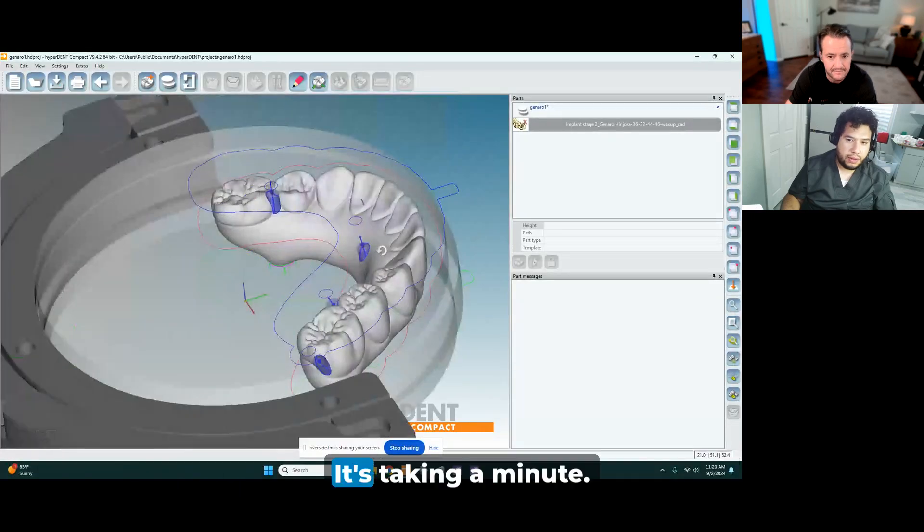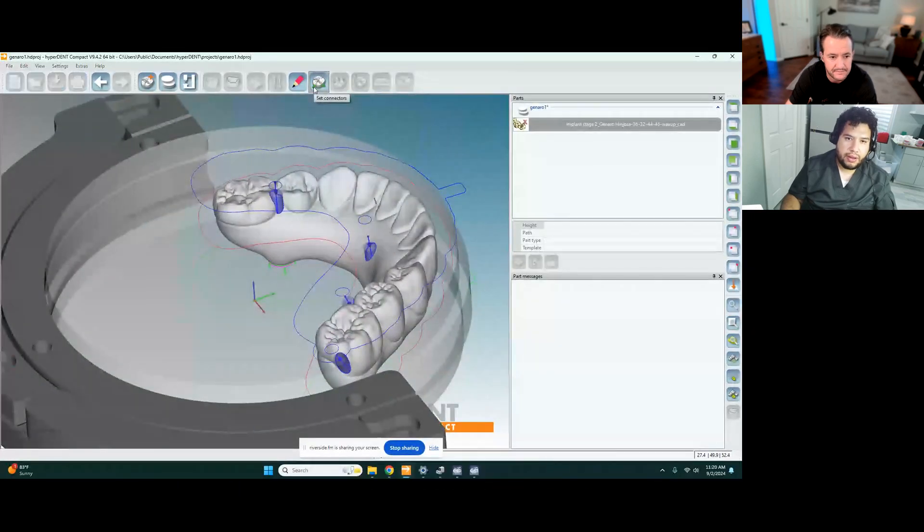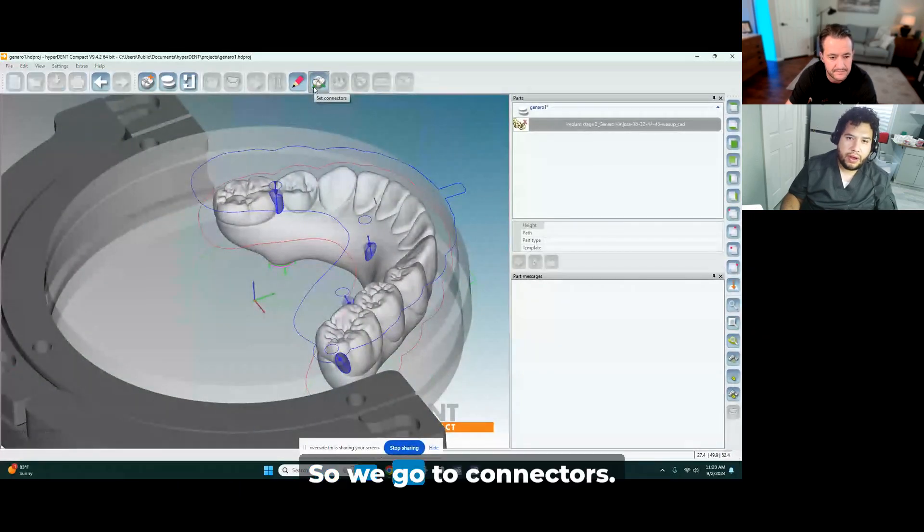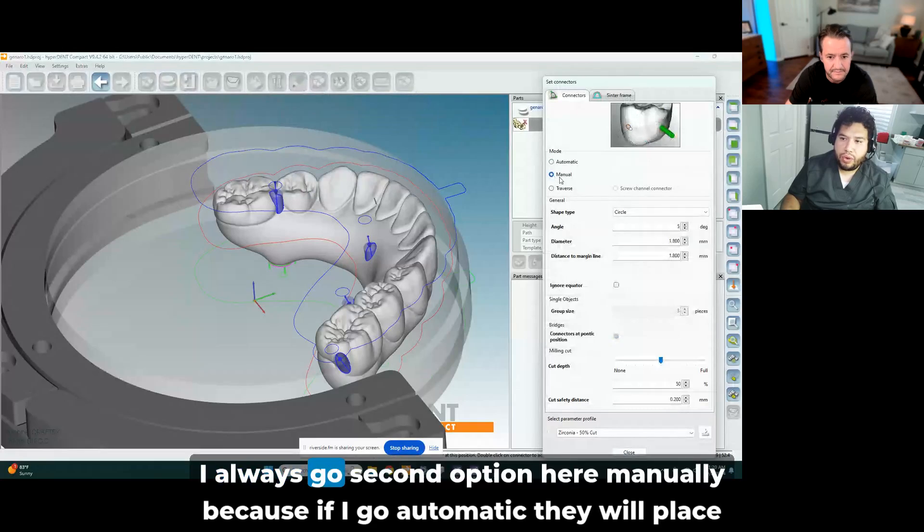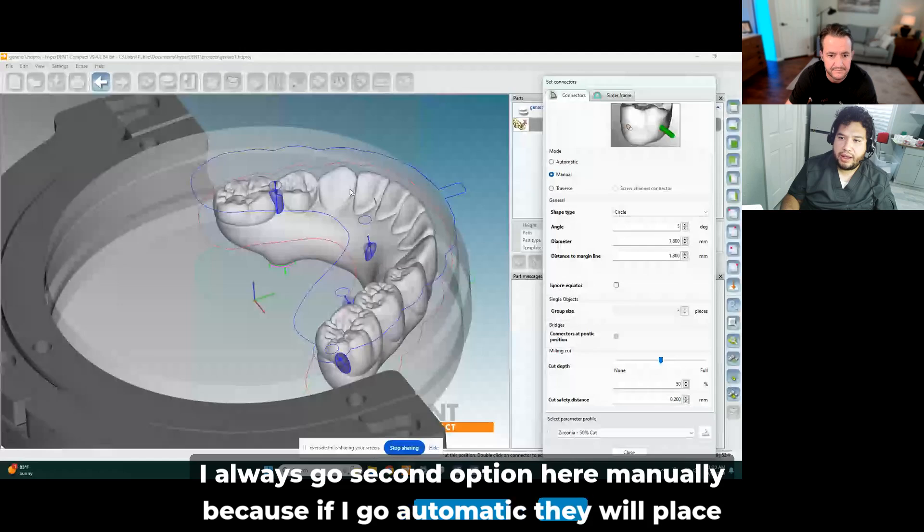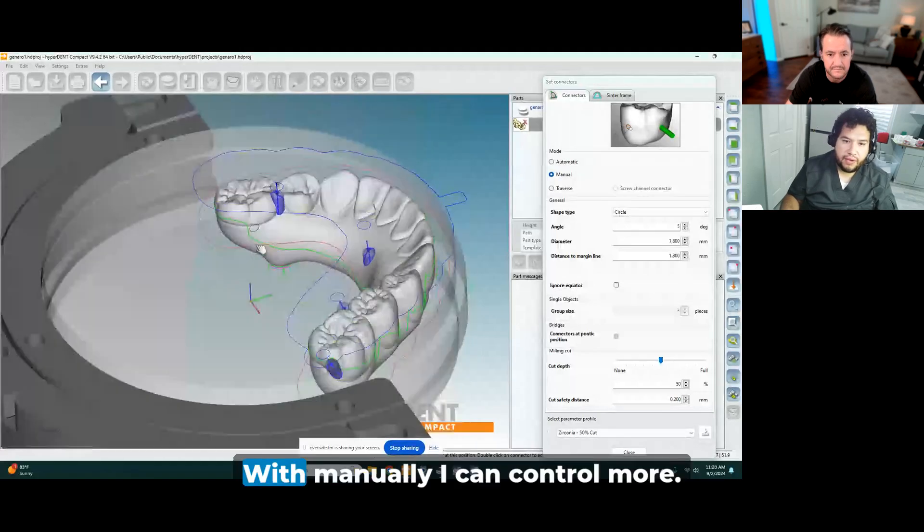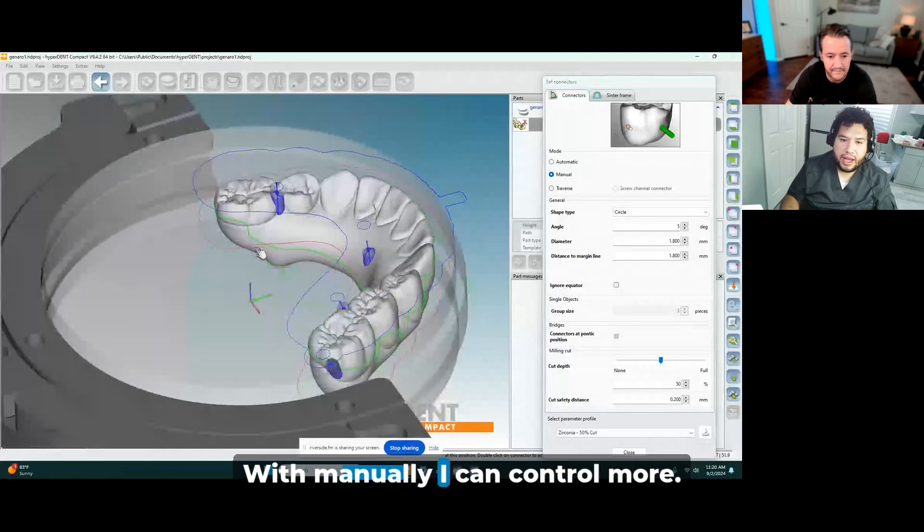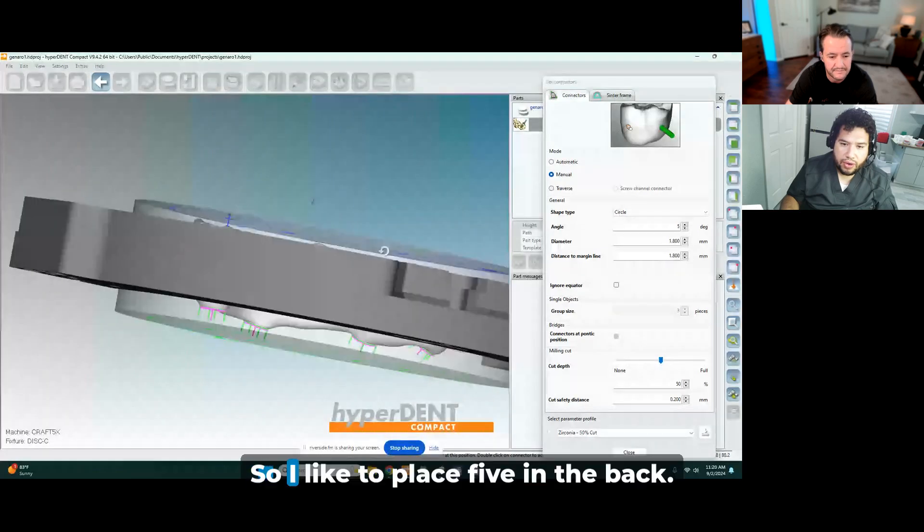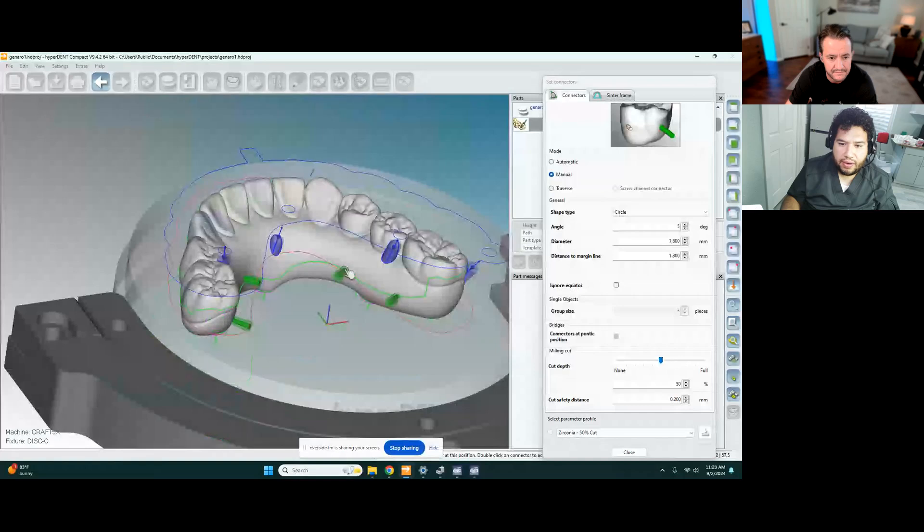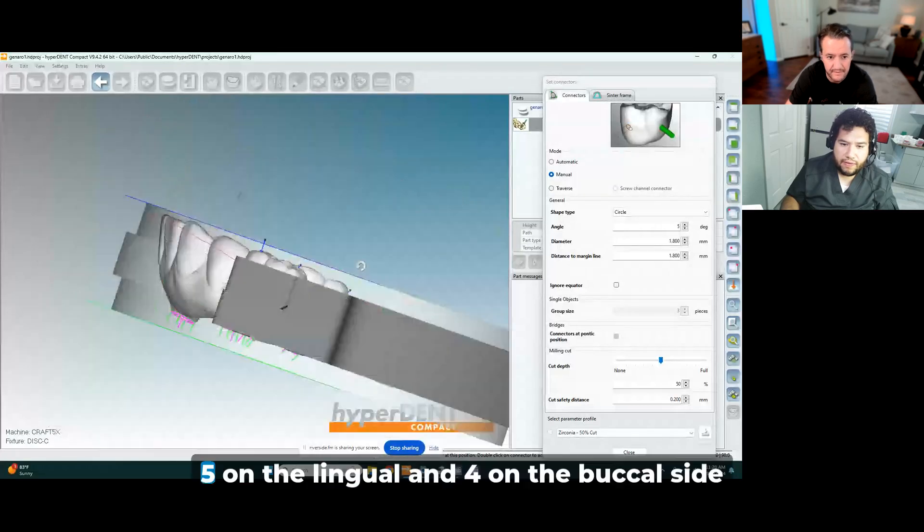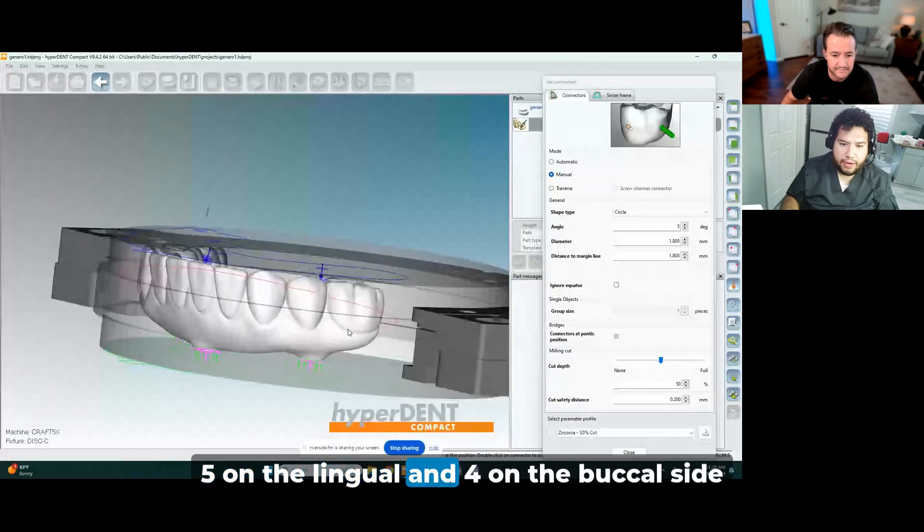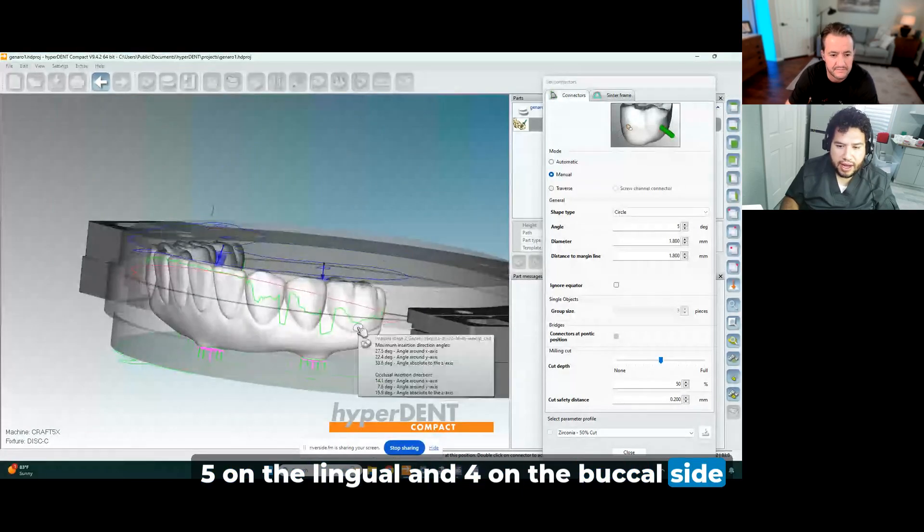So you're going to delete all of the connectors and then start over manually so that you can place them in the optimal position. Correct. So if I go automatic, they will place it everywhere. So I can place 5 in the back, 5 on the lingual. 4 on the buckle side.